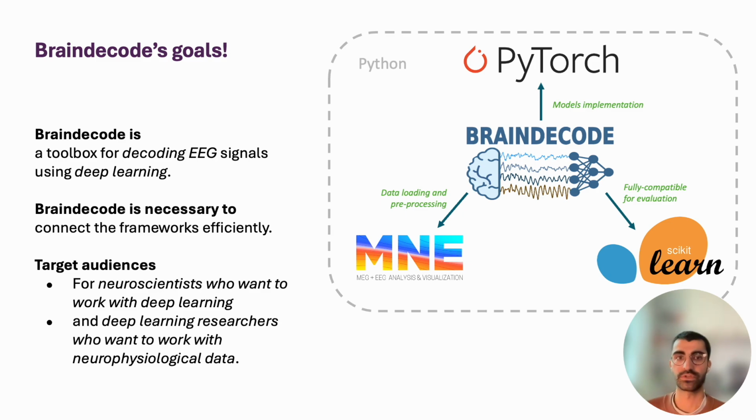And so we have deep learning libraries, such as PyTorch. We have EEG libraries, such as MNE, but they were developed side by side, in different contexts. So they were initially not meant to work together. And this is where BrainDecode comes in as a glue, basically, to make these different libraries communicate together, to have a smooth synergy and efficient data piping between those libraries. And so you see that BrainDecode comes on this diagram on the right side.